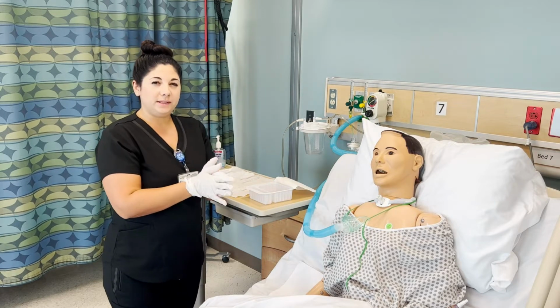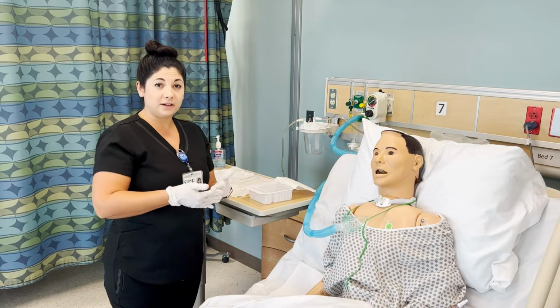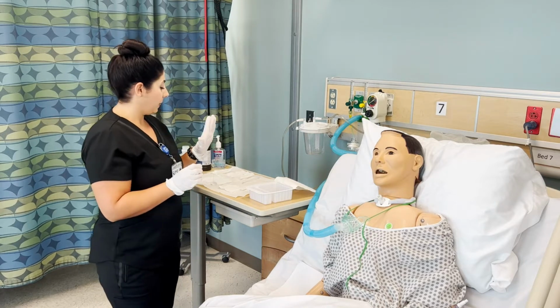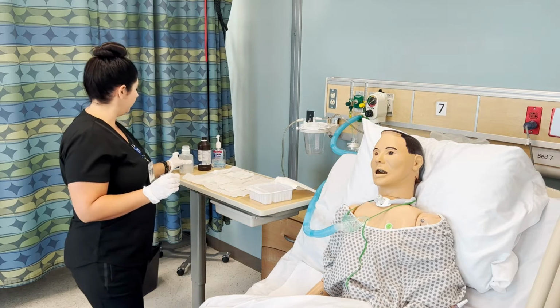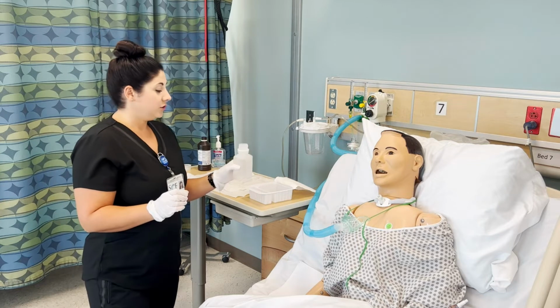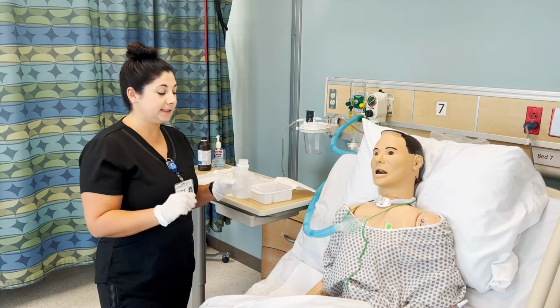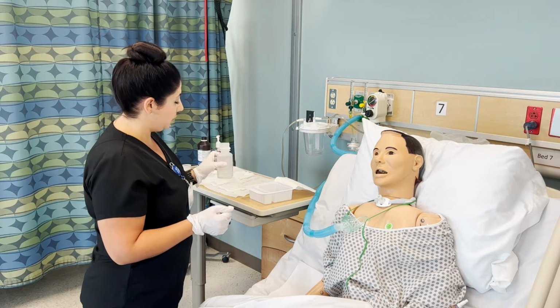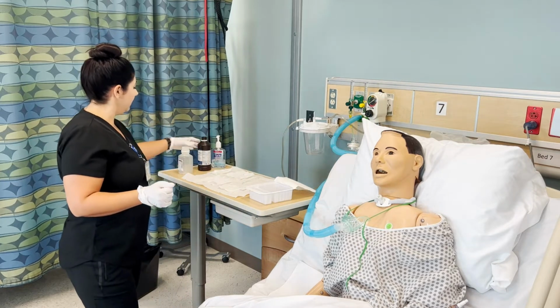Depending on your hospital policy, you may need to hyperoxygenate your patient. If they are not on oxygen already, they probably don't need it. So we will go ahead and lose the sterility of this hand and pour our fluid. Make sure not to go over your sterile field. Check your hospital policy with whether you should be using hydrogen peroxide or just saline. For our purposes, I'm going to use saline in the small area and saline and hydrogen peroxide in the larger one.